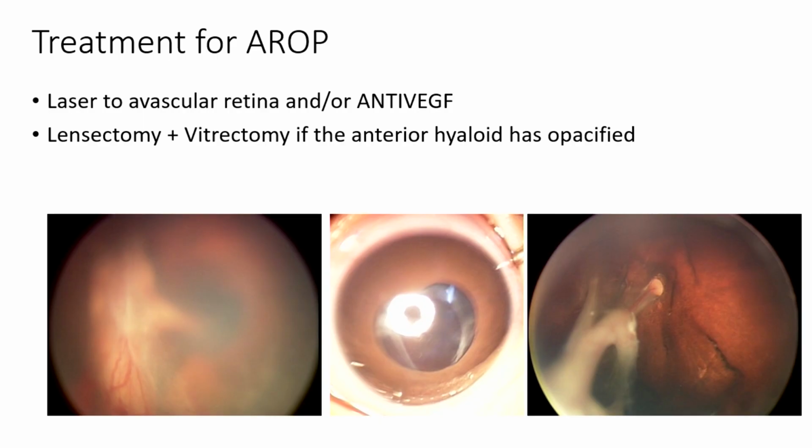One good thing is that if you want to retreat, especially in reactivation, you can try FFA first and treat exactly the areas where you can see avascularity. So in babies, we can do FFA and treat accordingly. This is especially true in the anti-VEGF era. You can do FFA and look at the areas. And if you don't have an FFA, and you treat all the skip areas, you can even treat the vessels directly. There's no harm in that.